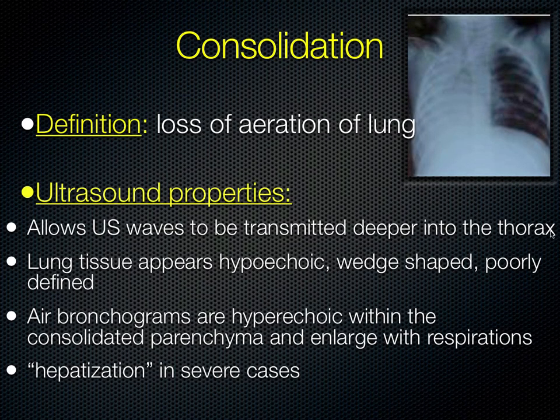So what is consolidation? Loss of aeration of the lung for any number of reasons. It can be atelectasis, consolidation, contusion, and so forth. But the fact that the lung consolidates and loses its air means that it can then transmit ultrasound waves, whereas before the air would scatter the beam.